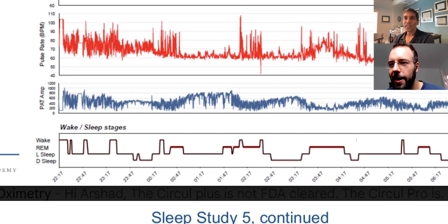You nailed it. Yeah, I thought so. I was just going to repeat basically what I was saying, but just terrible data. For some reason, they're genetically gifted and they just sleep through all of it. They go through all the sleep stages, kind of okay, good enough, and they wake up and they feel fine. They never want to address it.